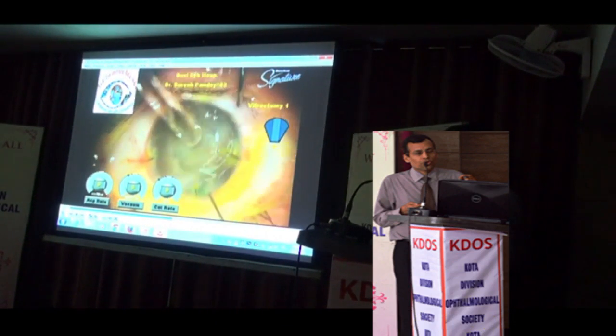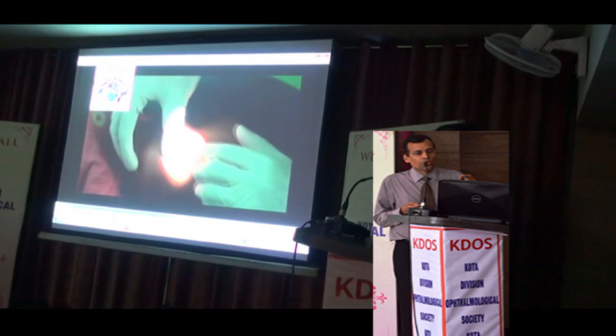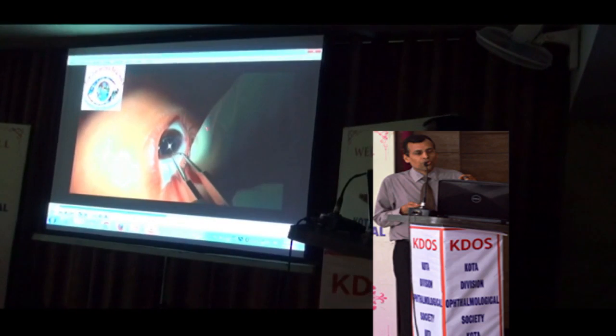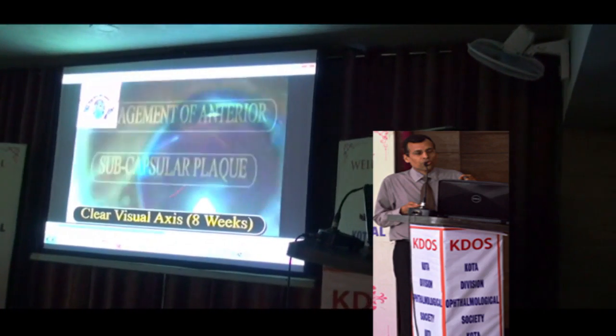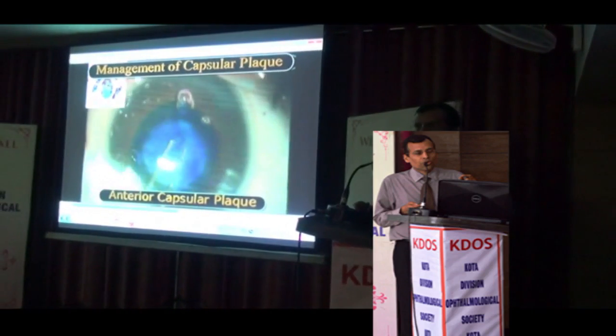Once the chamber is sealed, we normally do an examination under anesthesia after 6 to 8 weeks, and during this period we can also remove the sutures. So this is the clear visual axis 8 weeks after surgery. This is another case.